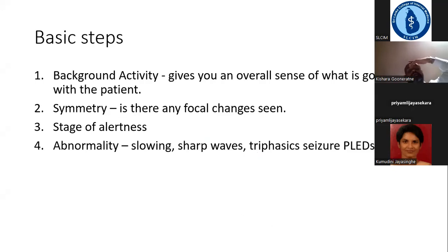Coming to the basic steps in any EEG, as soon as you look at an EEG, your first glance is to look at the background activity. The first step would be to look at the background activity, which is the overall picture of the EEG and gives an overall sense of what's going on with the patient.